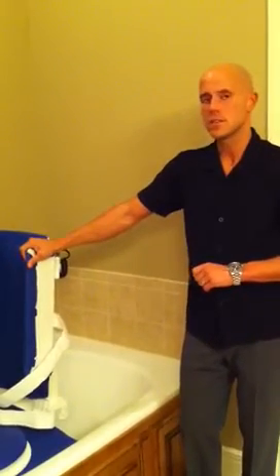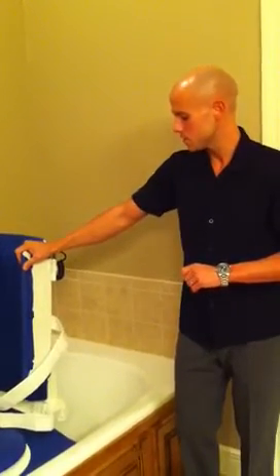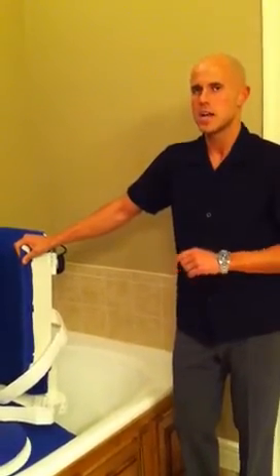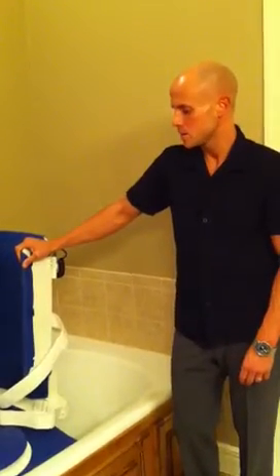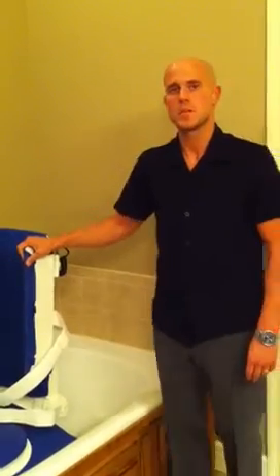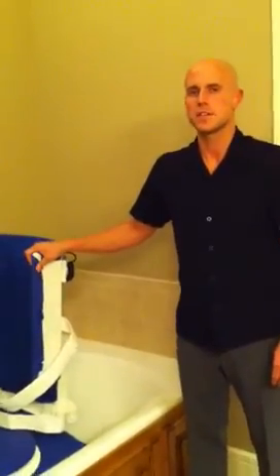The warranty on the lift is a three year standard warranty. Other accessories included are oversized suction cups and height adapters. So if you've got a deeper tub, we can accommodate that as well. Please visit us at www.clarkhealthcare.com and take a look at the rest of the accessories and bath lifts.